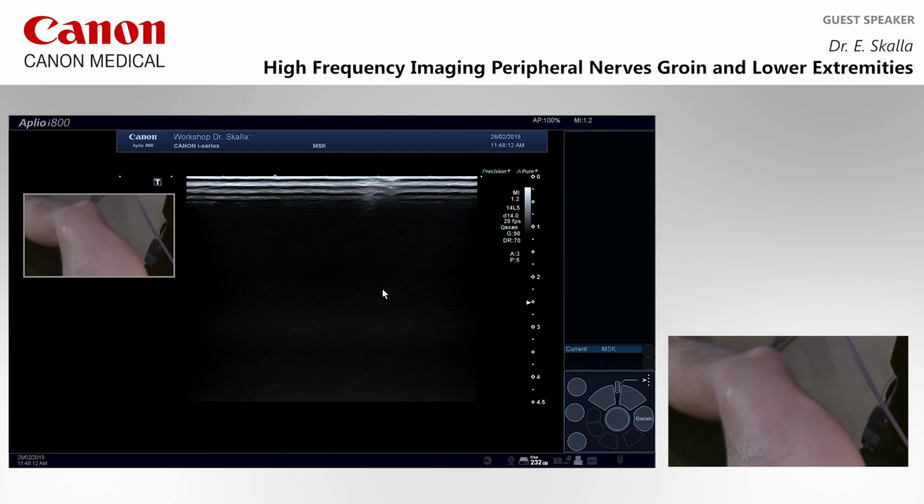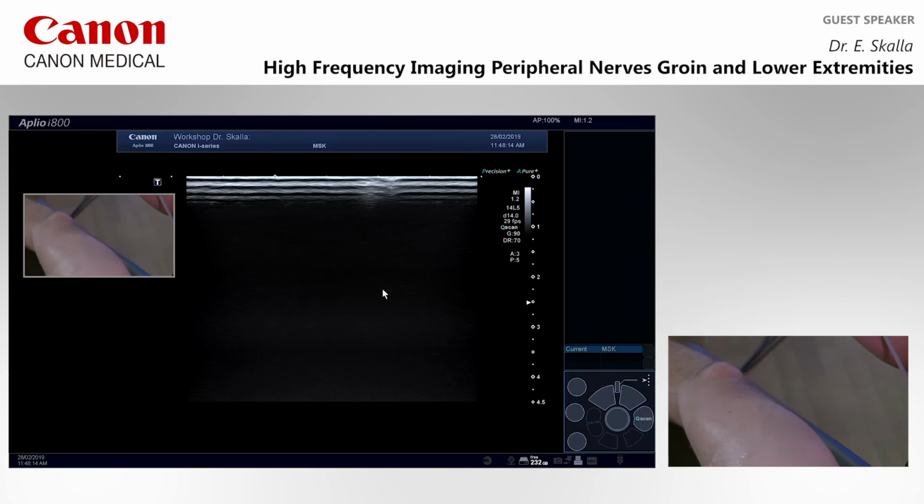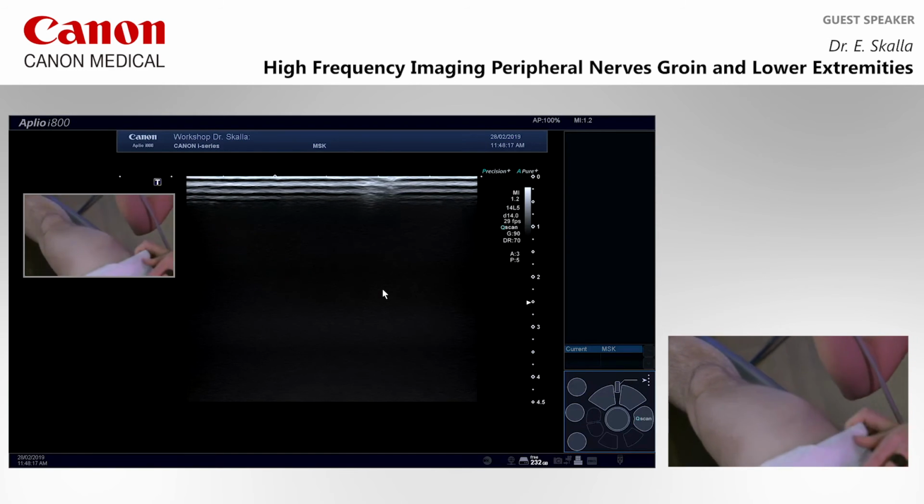Gut. Then, was machen wir denn? Die border nerves. Gerade da oben ein bisschen fein machen.